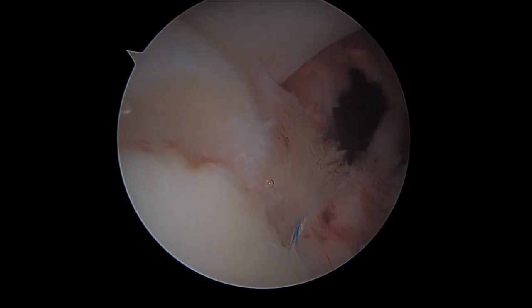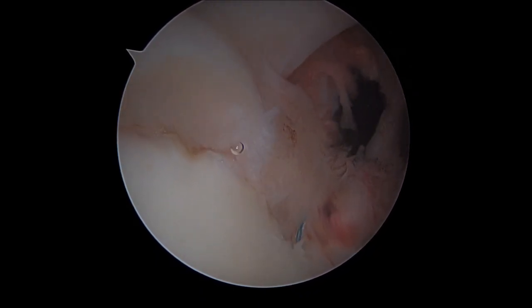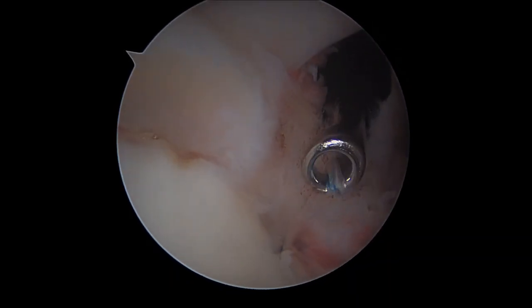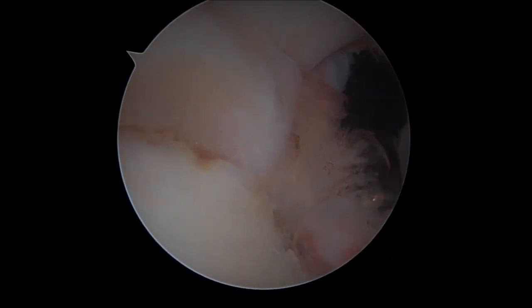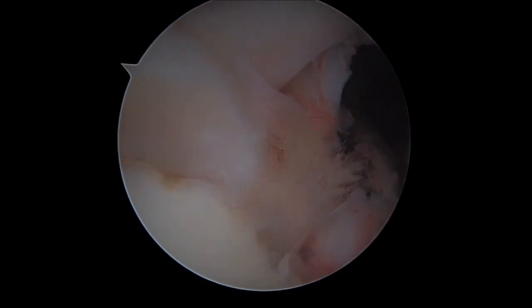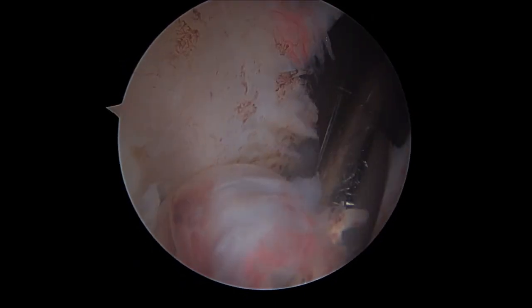We start giving our knots in order to stabilize the anterior superior aspect of the SLAP tear.